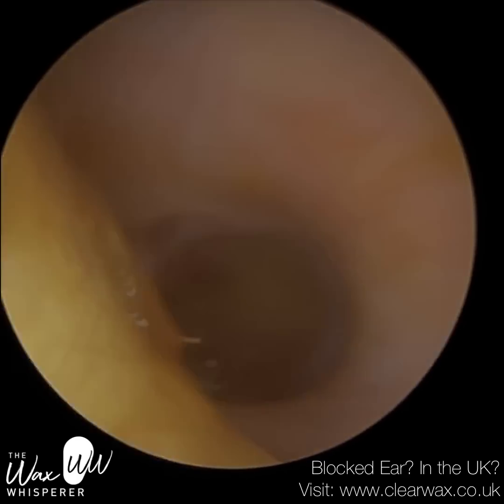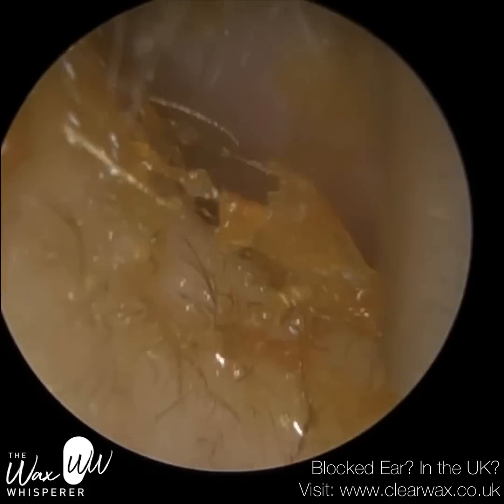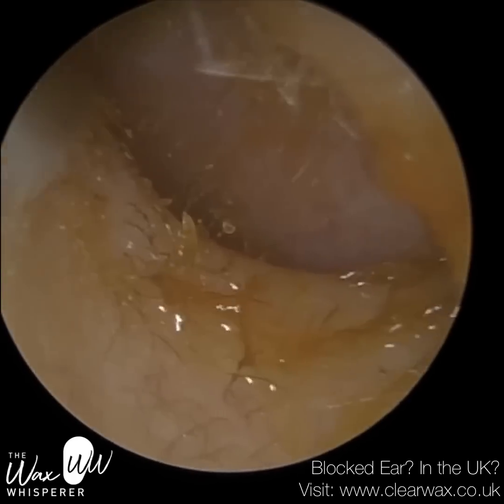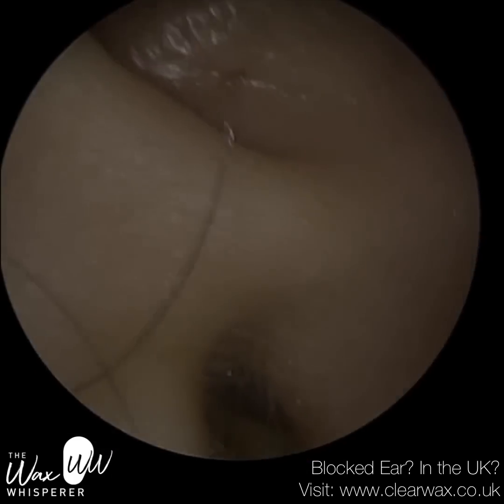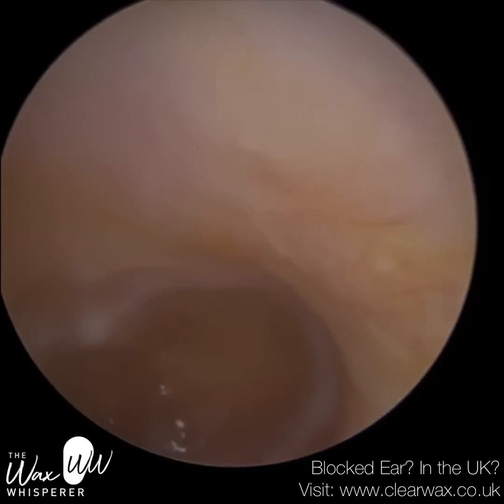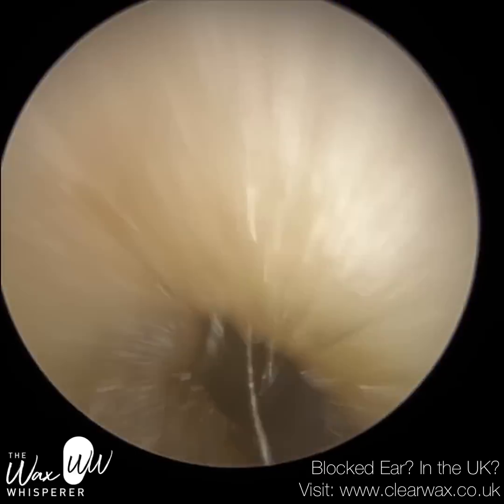The middle ear fills up with fluid. The eardrum is dulled — you can see the effusion is quite yellow; effusion is the medical term for fluid. The eardrum's retracted as well. There's quite a twisty bend here — the eardrum veers off to the left. If the fluid is unable to drain and the eustachian tube doesn't unblock itself, it will collect and can eventually burst through the eardrum, leaving a perforation. You can see that yellow mist in the background — that's all the effusion — and the eardrum is quite red, so it's inflamed too.